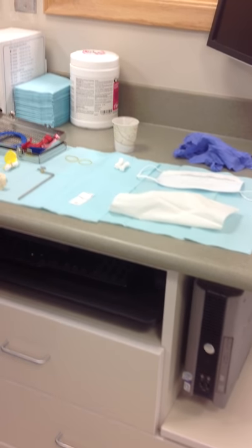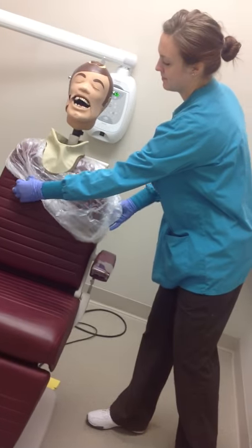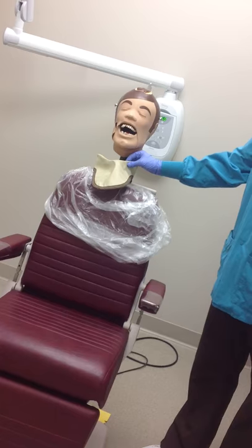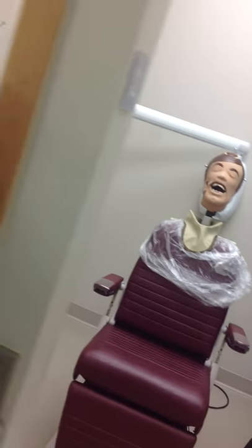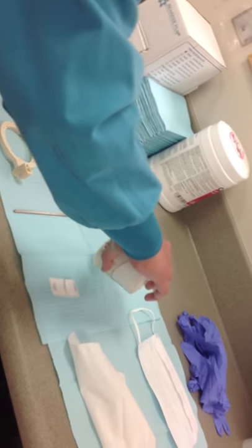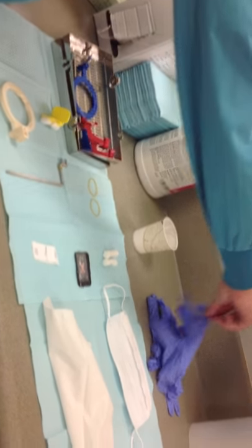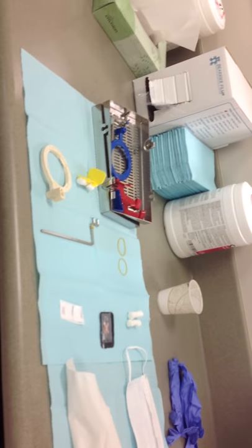Place two blue napkins on the countertop. Cover the exposure button with barrier film, and then bag the patient's chair. Once the patient is seated, put on the thyroid collar. Next, dump the film onto the napkins, making sure to only touch the Dixie cup with bare hands. Glove up, open the cassette, and place instruments on the napkins.